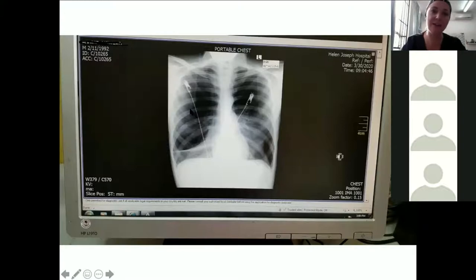If you have a look, can you see this white line over here? This looks like you've got a pneumothorax on this side, and it looks like that whole right lung has collapsed down. Let me try and bring up that nice line. Here we go. That's your pneumothorax line. So you've definitely got a pneumothorax on the right. You can see out towards the peripheral sides, you've got no lung markings over here. You do have some lung markings in the middle, but then you've got fibrosis right down at the bottom.